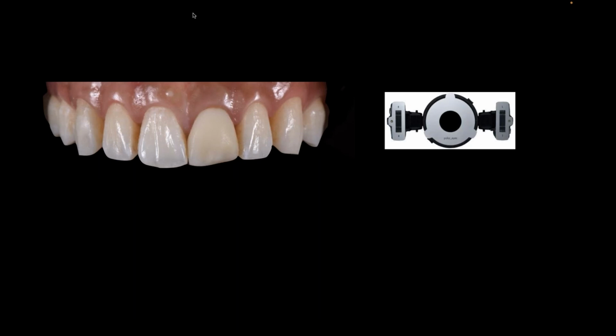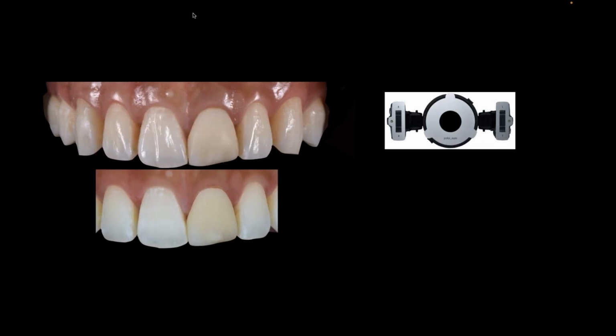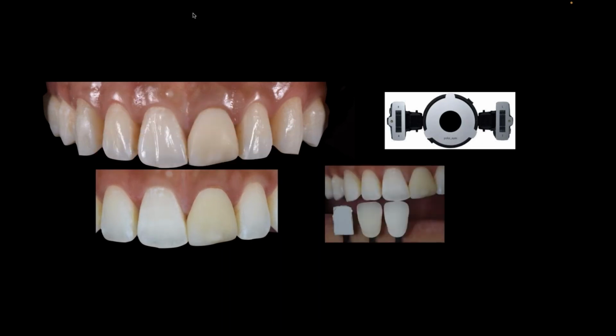Obviously, I'm using polarized almost all the time, especially for single or two teeth, because the polarized filter gives me the ability to see more inside the tooth. When you look at the tooth this way, you can see the white frosting is more on the surface. You can see a band of white enamel that flows through there. And you can see the opacity in that center third of the tooth that I would want to really try to do in my build-up on my restorative process. So the polarized really helps me there.